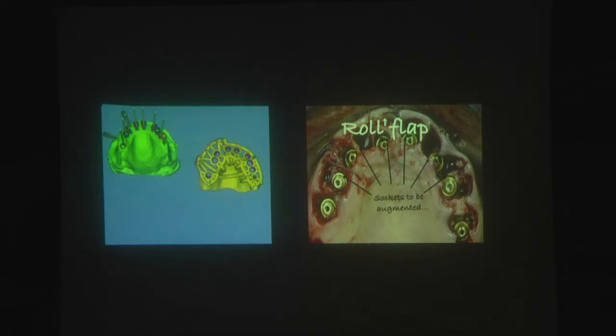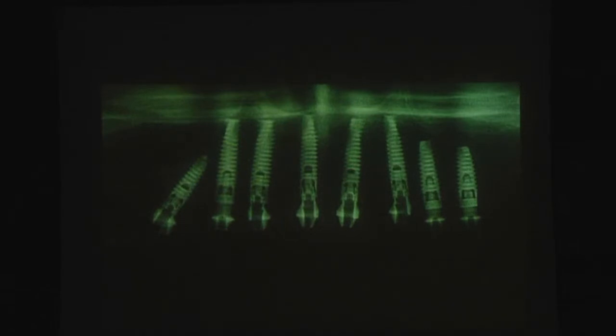And as you can easily remember, there is a unique instrument coming in the implant product box. It is a final drill. When you use it without rinsing, you can harvest autogenous bone, and we can put it in the extraction sockets. Once it's done, we place the implants, one tilted and the others straight.